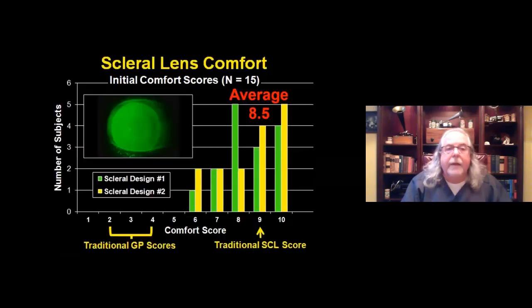So virtually all of these eyes would probably best be served with some type of scleral lens modality like the ICD FlexFit. Now, let's take a look at comfort.